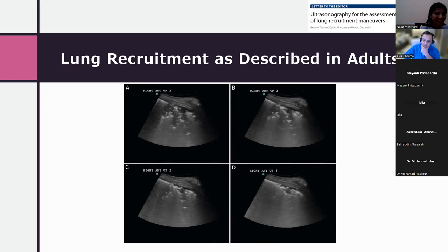I think you need to think of something else. Maybe that's a lack of experience, and I'm going to be humble enough to acknowledge that. I'd be happy for others to share their experience. But on non-invasive ventilation, you have scope, because you're going to be less damaging. But if you have a baby who has pneumonic consolidation with atelectasis, an extremely preterm baby who's 7 or 8 days old, whose lungs are still really fragile, the real risk is you might end up with a pneumothorax.